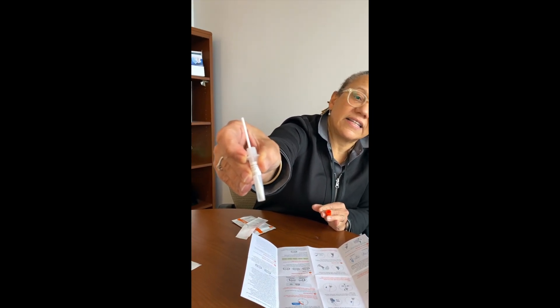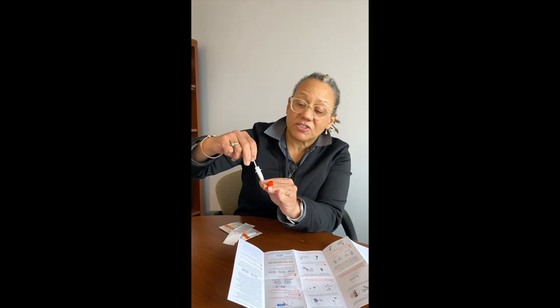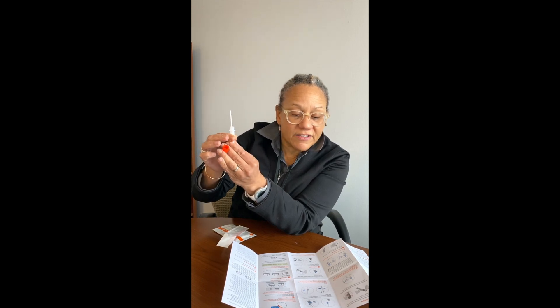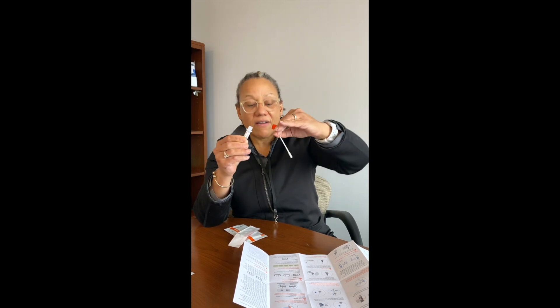You can see the swab is sitting in the liquid. Mix it around — the instructions say to stir 15 times — then squeeze the sides of the tube as you pull the swab out to get every drop off the cottony tip. Squeeze it as you pull it out, then close the tube by screwing the large orange cap back on. Put the swab back into its package and discard it carefully.